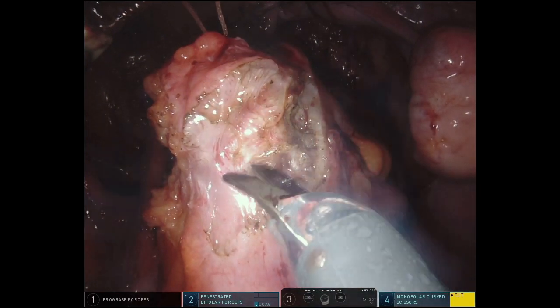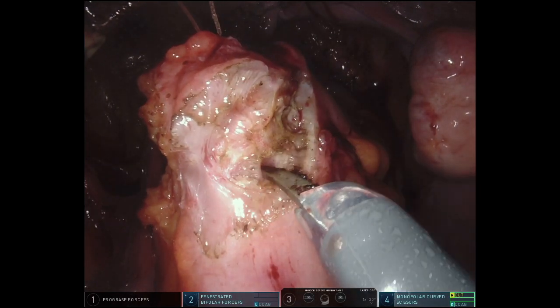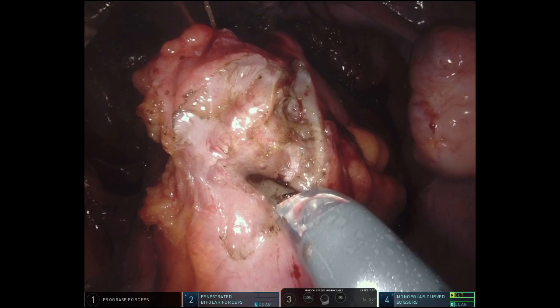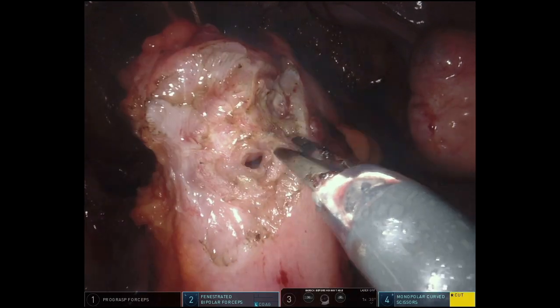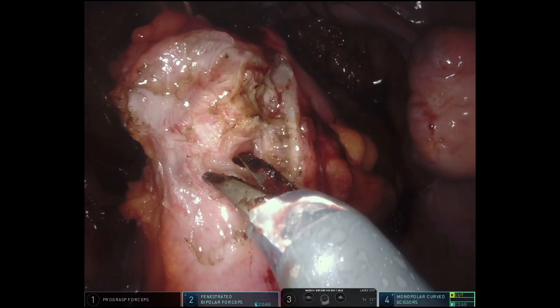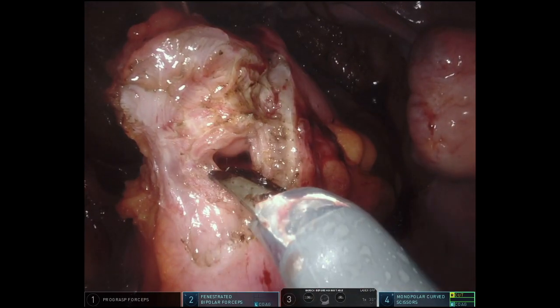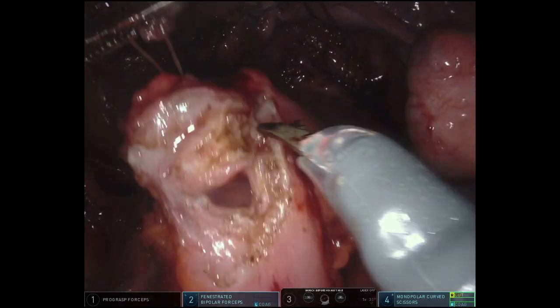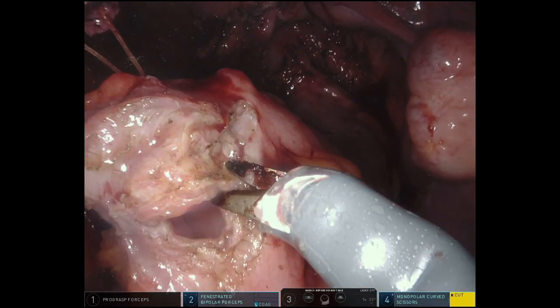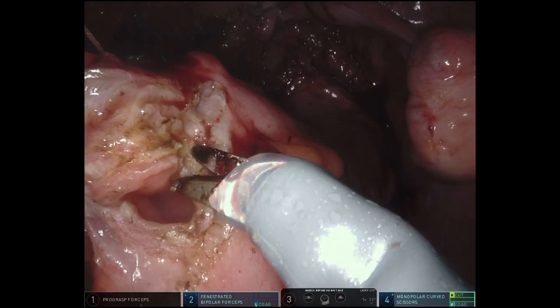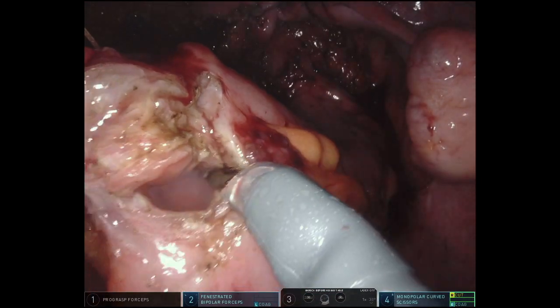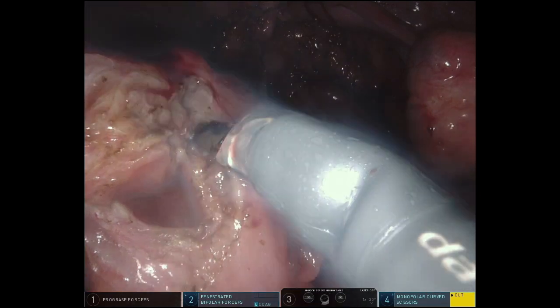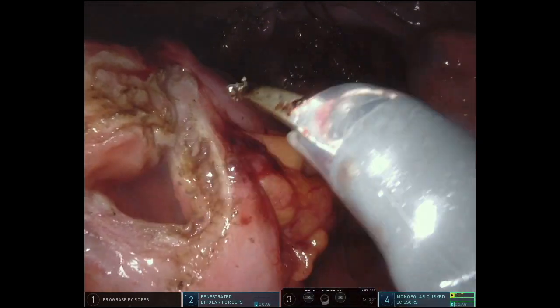To initiate the disc excision, a suture is placed through the lesion and lifted up by the third arm. We then use the monopolar cutting electrode to fully excise the lesion. By visualizing the motion of the tissue in response to the instruments, one can see that there is a dense nodule in the anterior wall of the sigmoid. We use cutting current at 50 to 60 watts in order to fully excise the lesion.